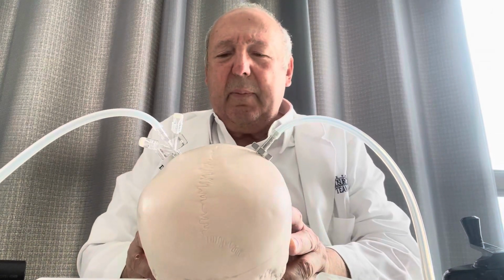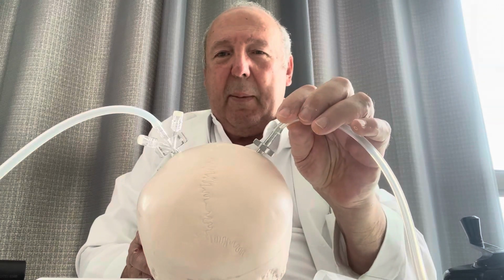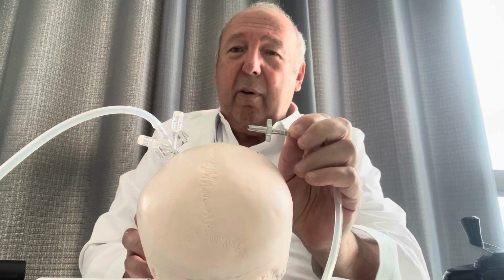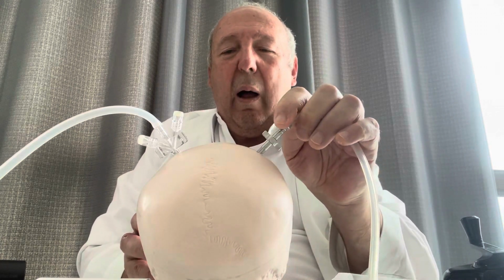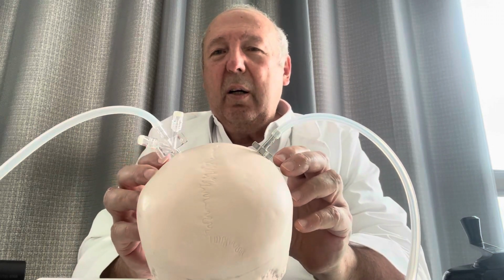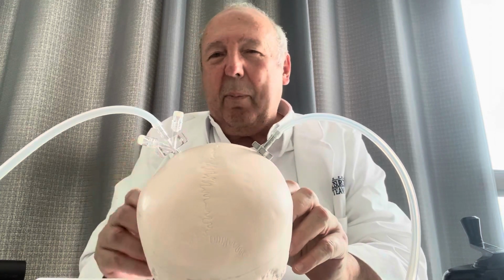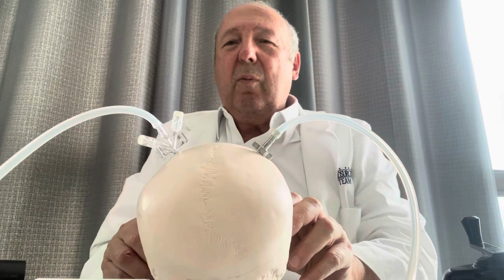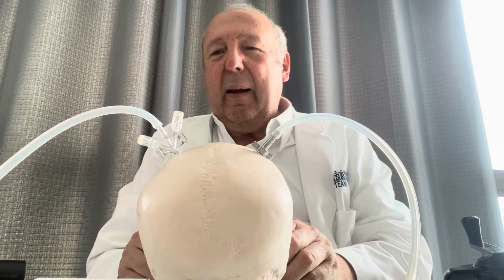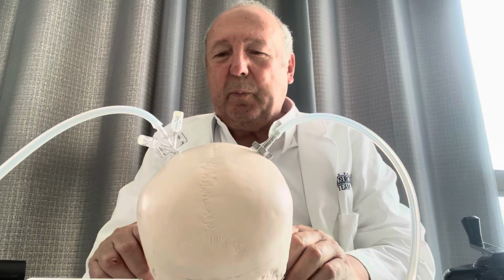The main difference between these two devices is that the SEPS is made of metal, and metal is very thrombogenic, while the NASP is made of an engineered polymer which prevents blood clotting. It's the same type of polymer used for tubes to collect blood from patients, and it's rare that the blood coagulates inside those tubes.